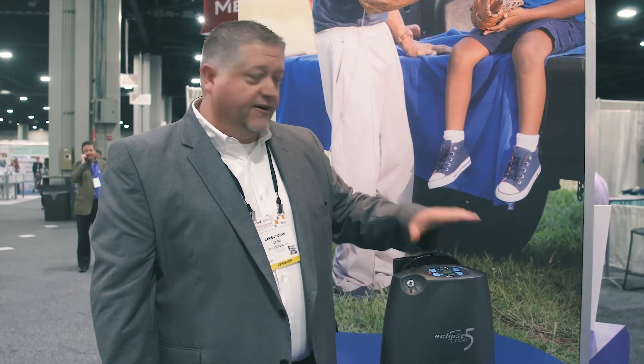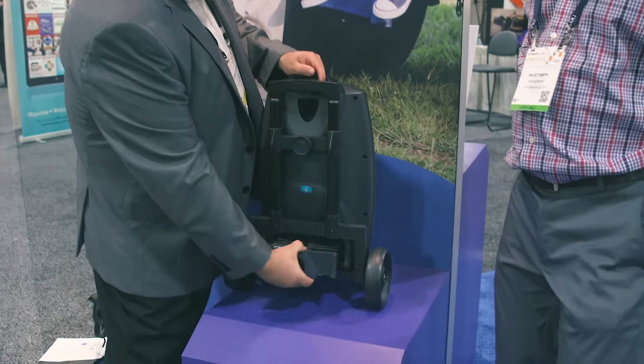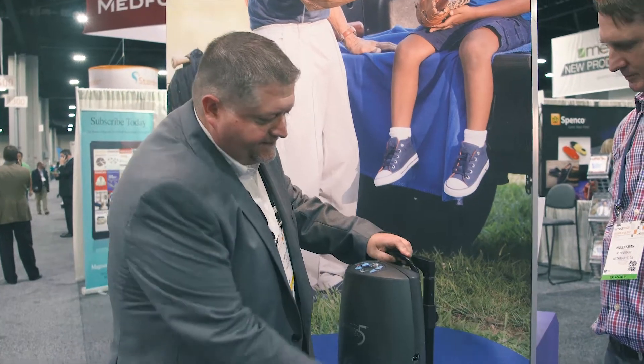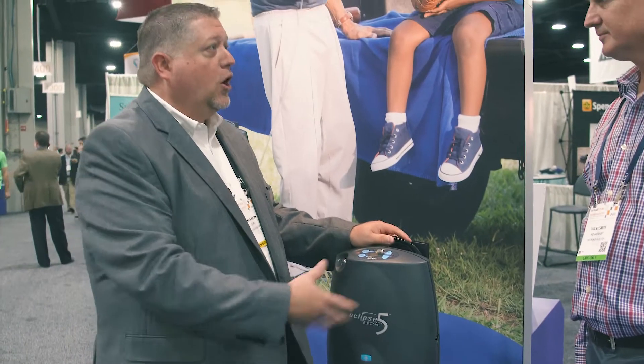Roll it off, and they can increase or decrease the liter flow. Battery power is off the back — that's off the back of the unit. Or if they're in the car, they can be plugged into their power outlet here to run the machine. They can just use the battery while they're out and about.